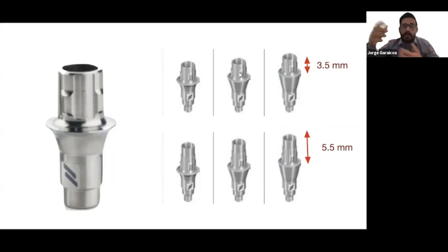Remember that, like you were saying, you need to also have a communication with your technician about understanding the process of bonding those zirconia pieces to the titanium abutments, right? We need to follow a protocol. We need to follow a surface treatment of the material, so we can achieve appropriate bond strength to the components. The other thing is also the height, right? If you have a very large crown that you're bonding to this very short piece of abutment, it doesn't make much sense to me, right?